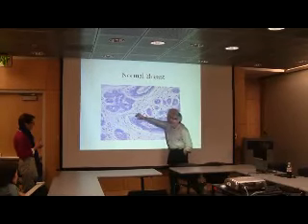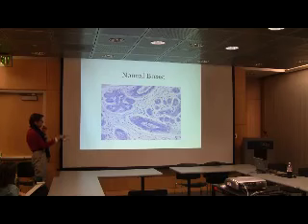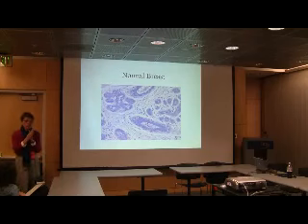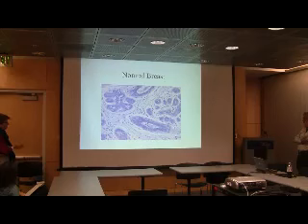But what about this, the artifact that we're seeing? Do you want to mention that? All right, so there are empty spaces here. In a normal situation in life, there are no empty spaces. Everything is up against each other like that. Although there are openings in the center of the ducts, where secretion of milk would come into this and be transported to the nipple when you're lactating.